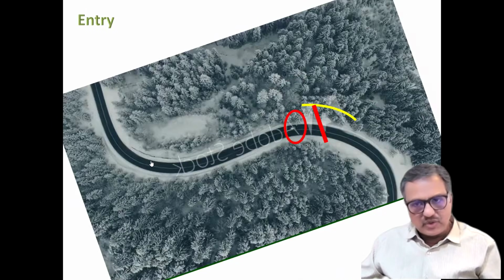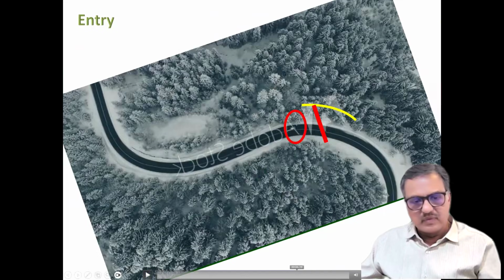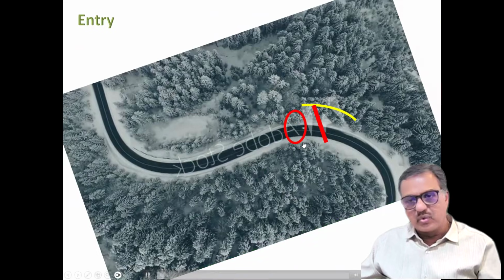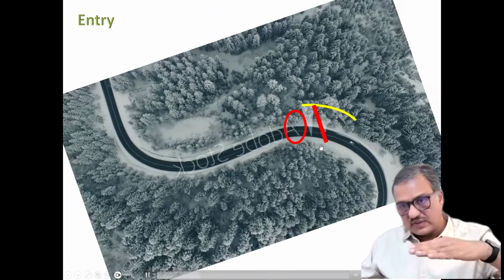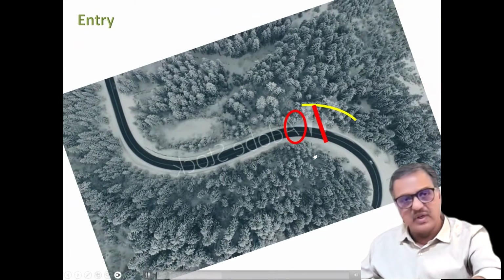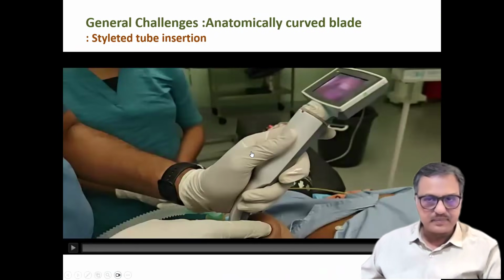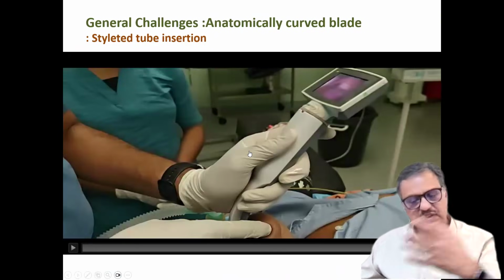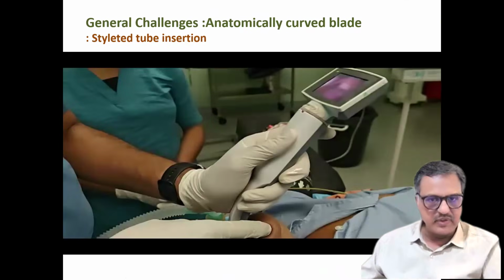As we discussed in session 1, once you cross, the trachea is going down, so in the same way you have to travel down with the tube. That creates a big problem. We will discuss that in a coming session on troubleshooting with the videolaryngoscope.